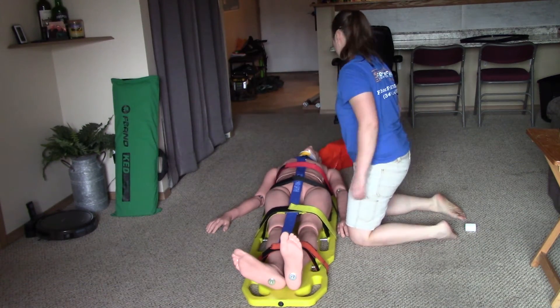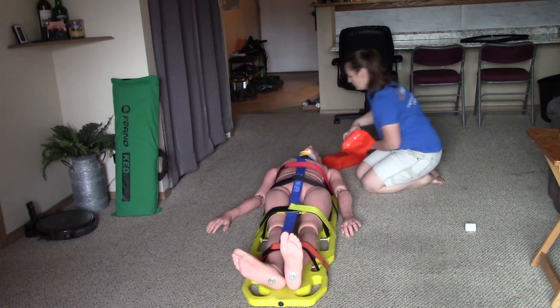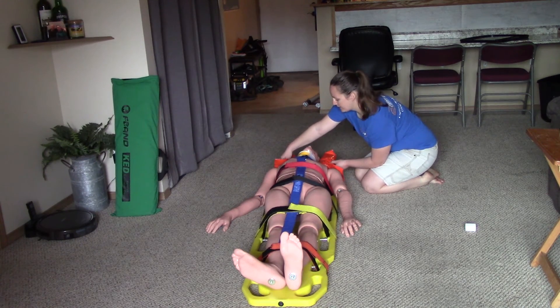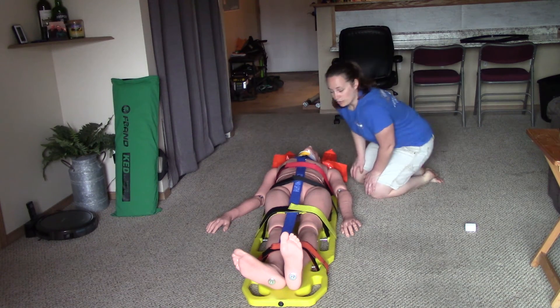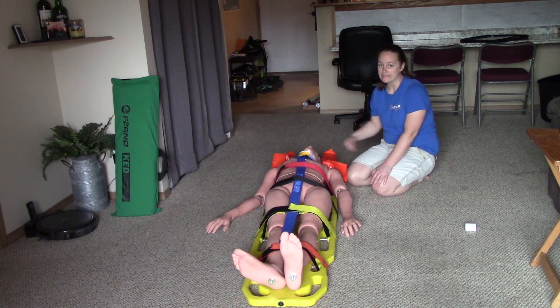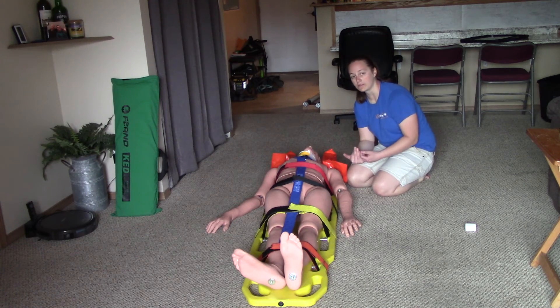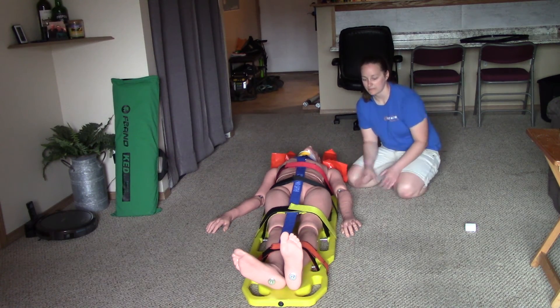At that point I have the patient secured to the backboard and I'm ready to secure the head. I'm going to put the head blocks in place and ask my partner to take C-spine outside of the head blocks. I will now verbalize the rest: tape the patient's head to the backboard, pad behind the head, pad the voids, tape the thumbs together, and recheck CSMs in all four extremities.